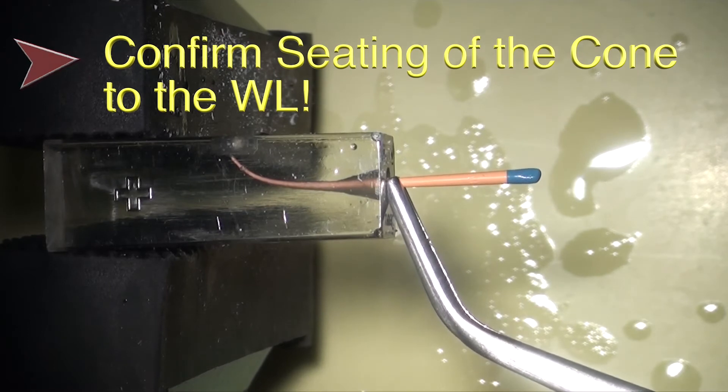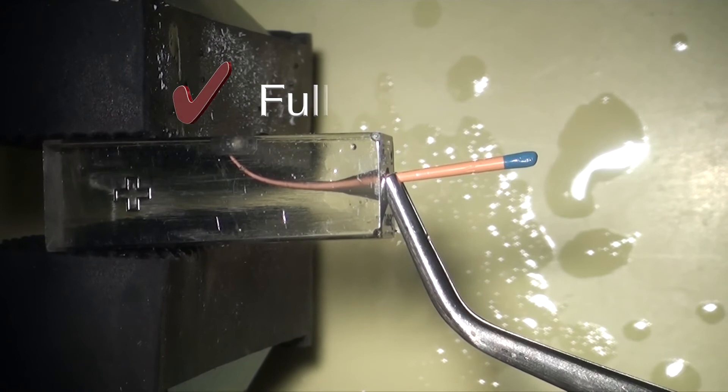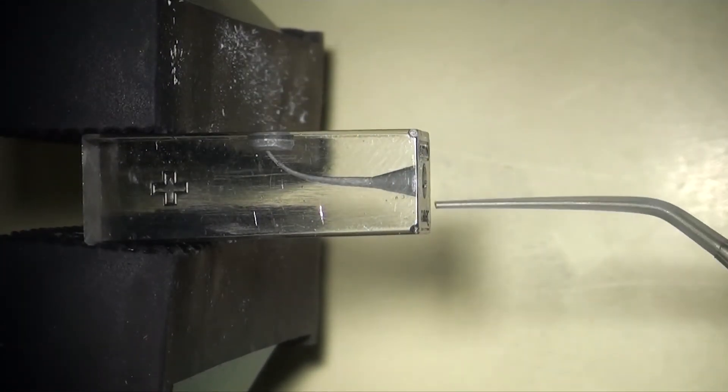Finally, you should fully seat the 30-04 gutta-percha cone to confirm that you have adequate cone fit. Next, you can apply and coat the canal walls with BC sealer using your method of choice.